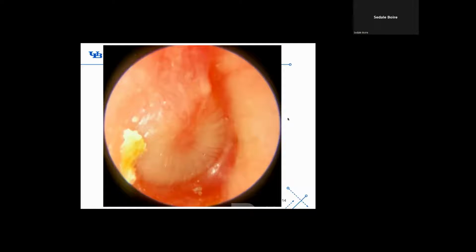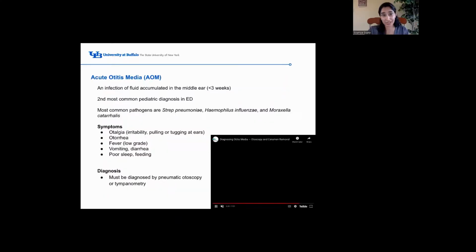Right ear. Yep, you can kind of see the malleus over here in the umbo. So this is going to be the anterior superior quadrant. And what else do you see? Just in general. The tympanic membrane is like bulging out. Mm-hmm. And would you say that it's pearly gray translucent or not? It's like inflamed, irritated. Mm-hmm. Correct. And is it retracted, bulging, or taut as it's normally supposed to be? Bulging. Yes. Any guesses on what this patient might have? Otitis media. Correct.